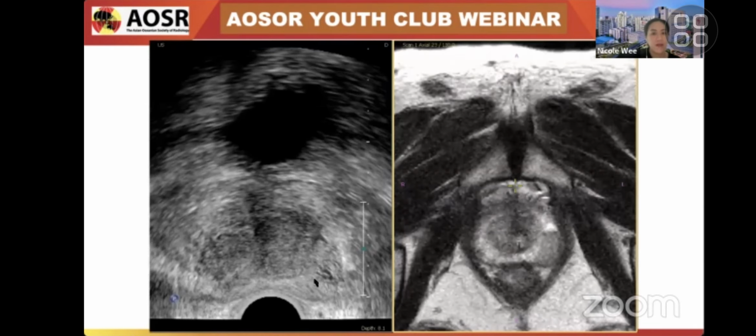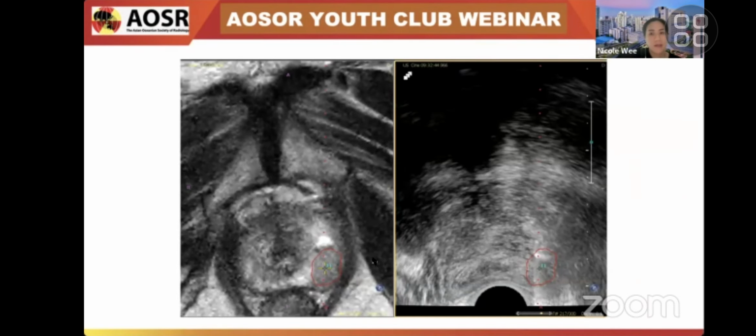And finally, prior to injection of the biopsy needle, you can see that without the fusion, the lesion actually looks iso to hypoechoic on the ultrasound image on the left, making it a bit difficult to detect. So the needle is then introduced in the final step. You can see it as this linear echogenic line coming in posteriorly, and target sampling takes place.